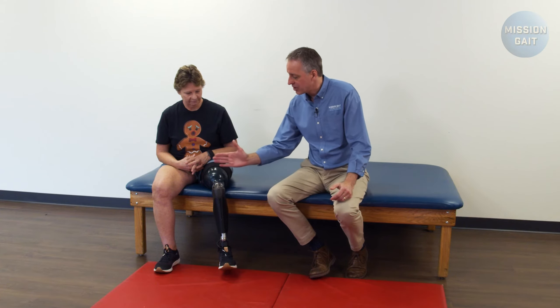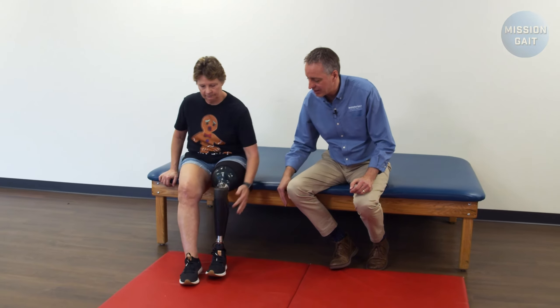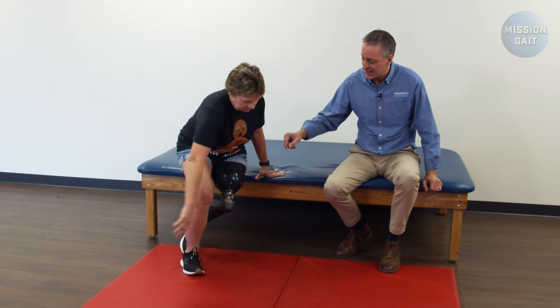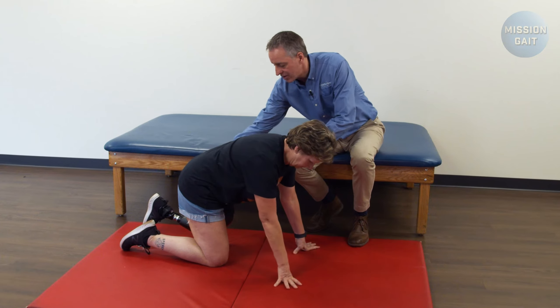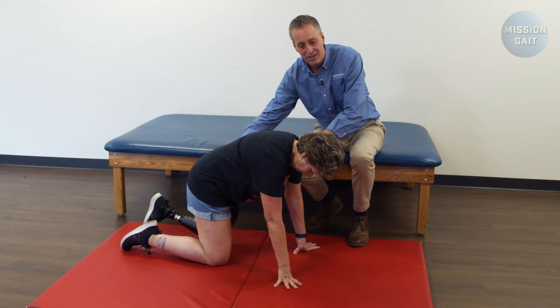The easiest way to do that is have the patient scoot forward on the mat slightly, tuck the prosthetic back underneath her a little bit, and then lean over, hand on the mat until she kneels on that prosthetic and comes right down on it. You can kneel on this prosthetic as much as you want — the pressure on the socket is no different than if she was standing, so she can put as much weight on it as she needs to.